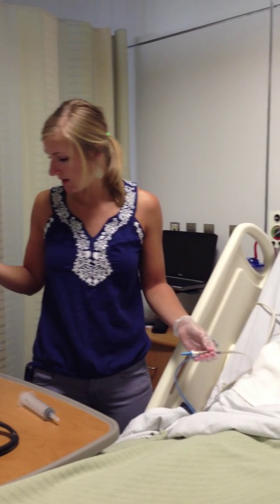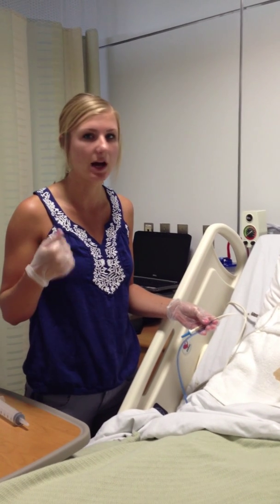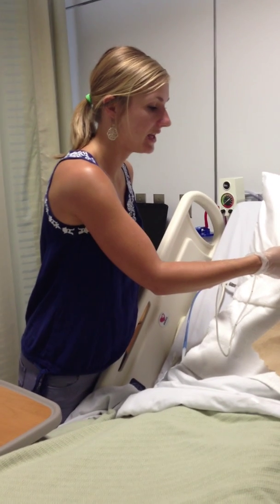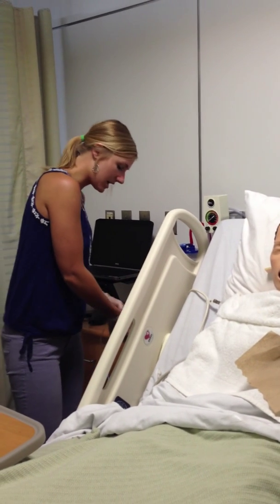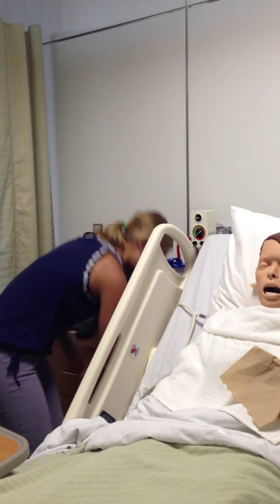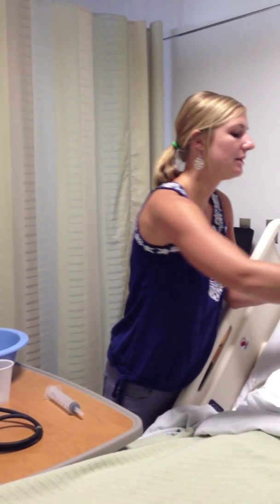Once the tube is cleared, I'll give the patient a towel so they can wipe their nose as any contents come up, making it less messy. Pretty much, I'm going to take the tape off, and in one quick fluid motion, pull the tubing out and deposit it right in the trash with my gloves. Then I'll clean up the area and document any changes or complications the patient had with the NG tube.